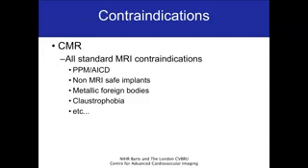What are contraindications to cardiac MR stress tests? In fact, all standard MRI contraindications, which include, as I'm sure you all know, permanent pacemakers, ICDs, any other non-MRI safe implants, metallic foreign bodies, claustrophobia, etc.